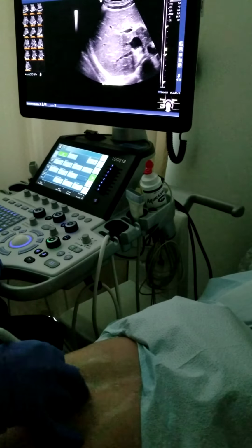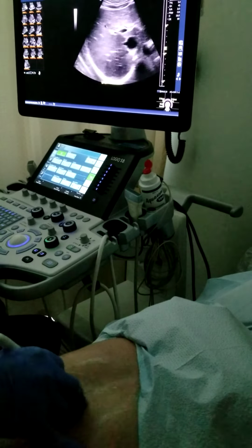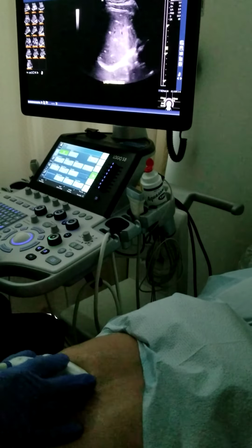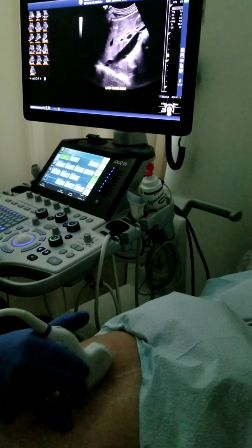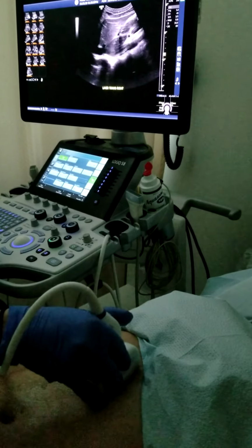That is our job, is to investigate each organ, look at the vessels, make sure we're not missing anything. So take that time. That's when you can relax this left hand. Go ahead, breathe. And just really take your time. Two planes. Sweeping, sweeping, sweeping, and looking for anything that is out of normal.